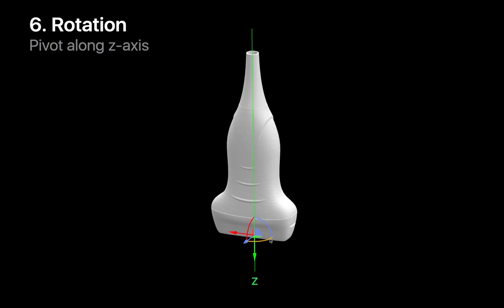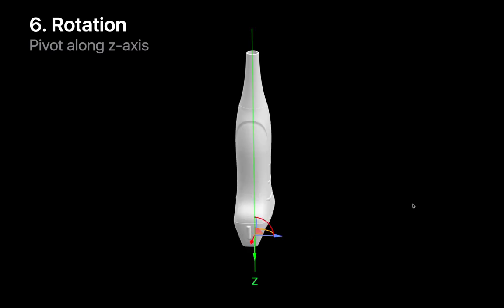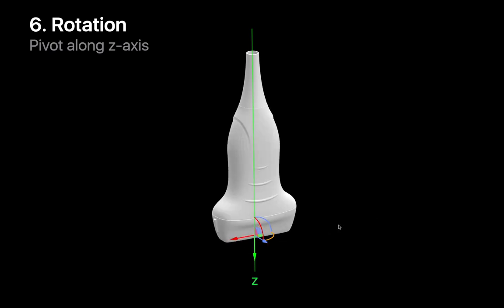And pivoting the probe along the axis of the transducer cable, either clockwise or counterclockwise, is called rotation.